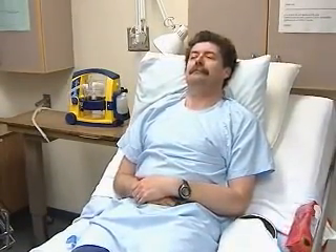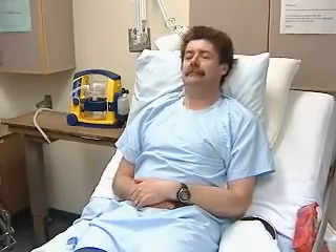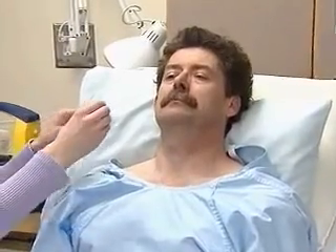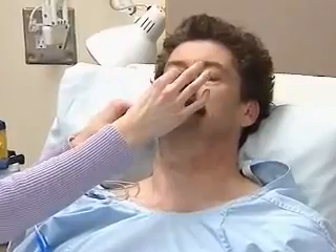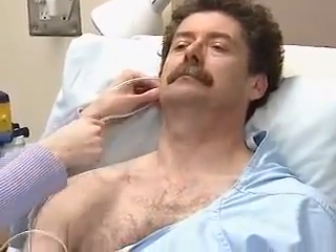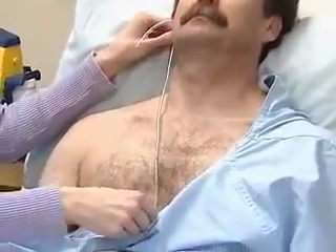Our patient is placed in high Fowler's position, with shoulders well elevated. We gauge the length of tube to be inserted by measuring from the tip of the nose to the earlobe to the xiphoid process. Mark the length of tube to be inserted with a bit of tape.